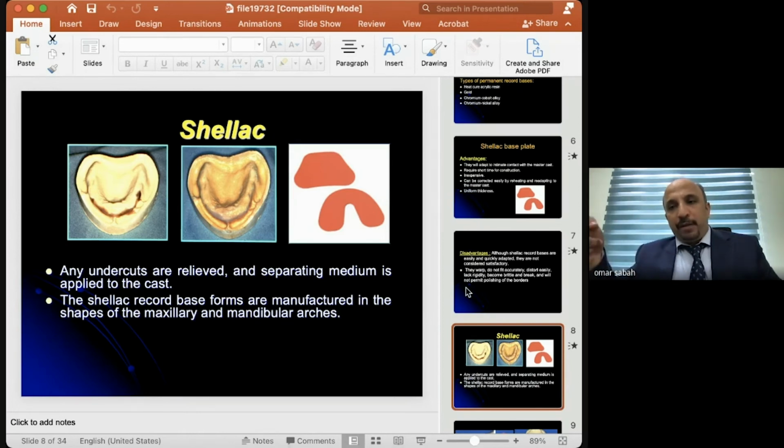So should we inform the patient that there are problems in the symmetry of the arch, or that it is shifted to the right or left, and you can speak to the patient. So from this point, when you're arranging the teeth and putting them on the articulator, this trimming procedure gives you full details about these positions.